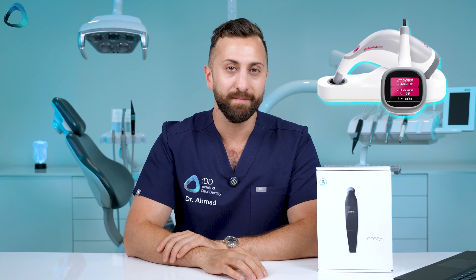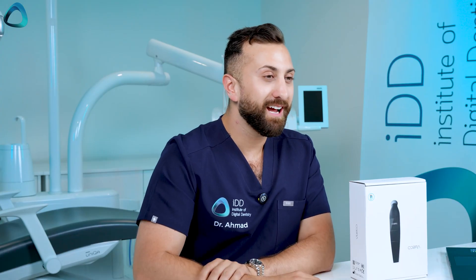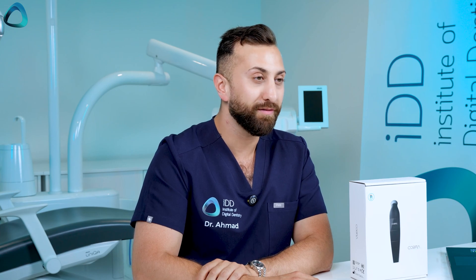The most popular spectrophotometer is arguably the Vita Easy Shade, but that device left a lot to be desired. I've used it and it's a little dated looking and doesn't have the same level of software or digital dentistry integration that we expect in 2025. With that aside, let's get into today's unboxing of the Borea Cobra dental shade matching device.